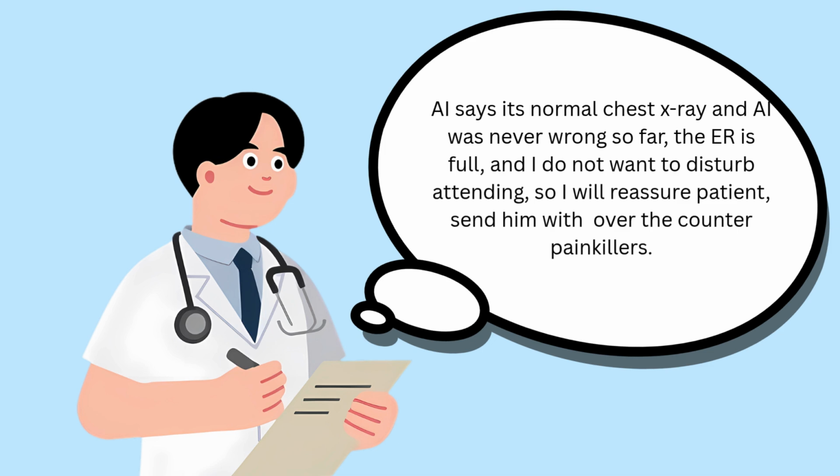The junior resident in the ER that day, unfamiliar with the limitations of AI triage systems, too busy with other cases, and since the AI was never wrong as far as he was a resident, interpreted the negative AI result as reassurance rather than decision support. Without even looking at the X-ray image independently or escalating the image for senior review, he diagnosed musculoskeletal chest pain and discharged the patient with oral analgesia.